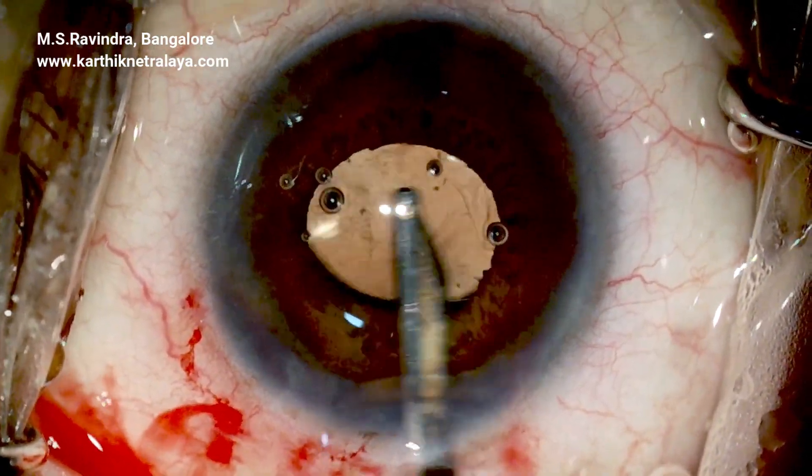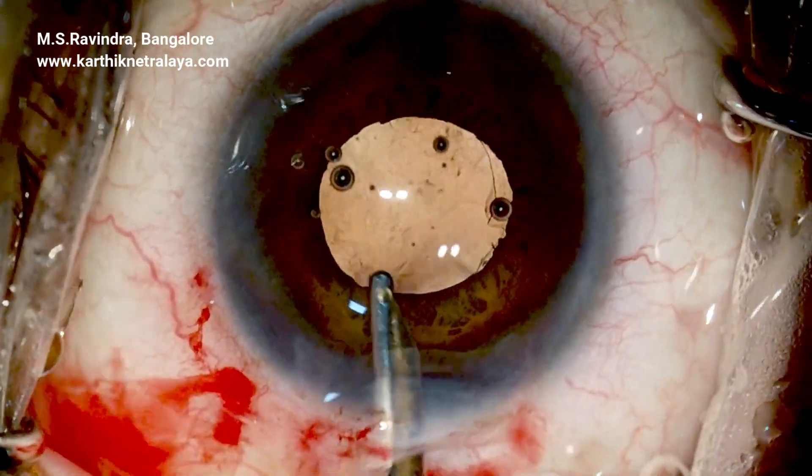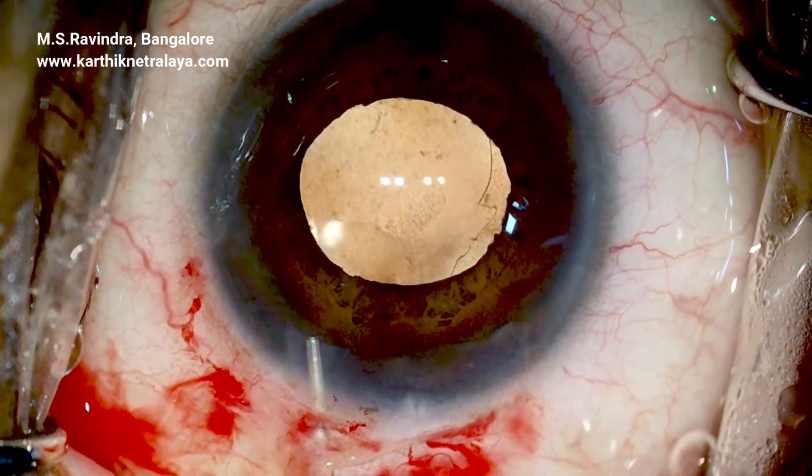The lens is washed all around, the angle region is washed, the chamber is deepened, and moxifloxacin is injected to conclude the surgery.